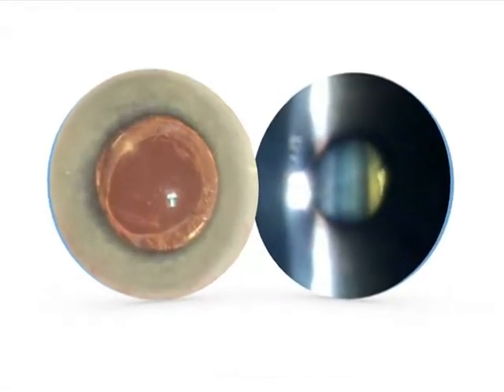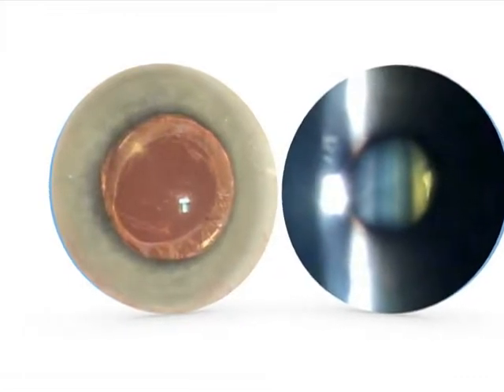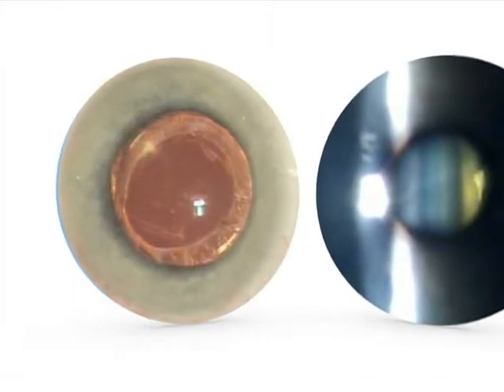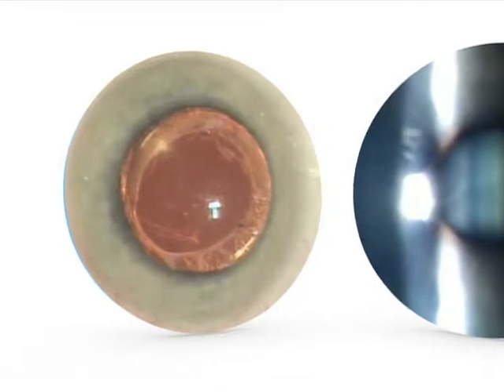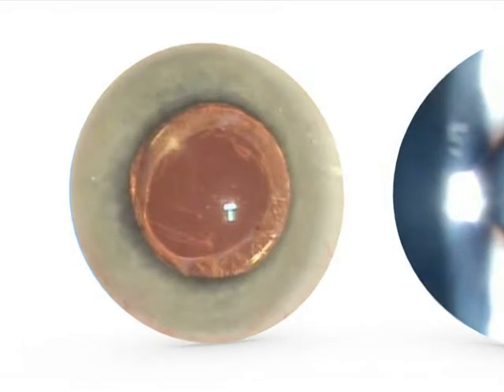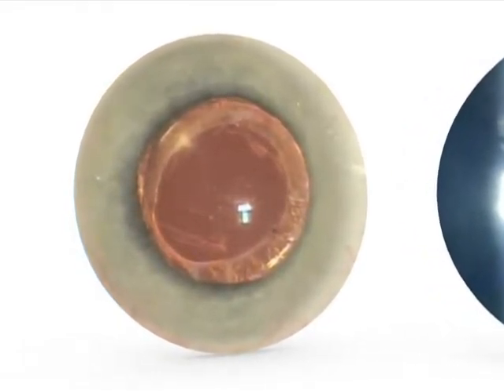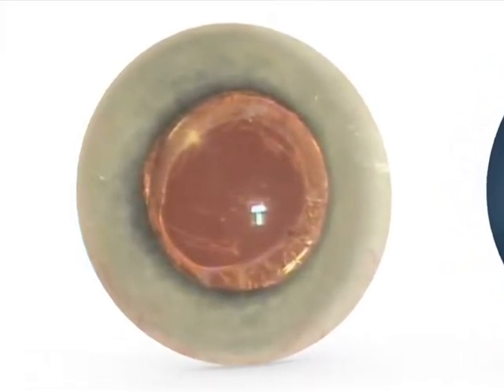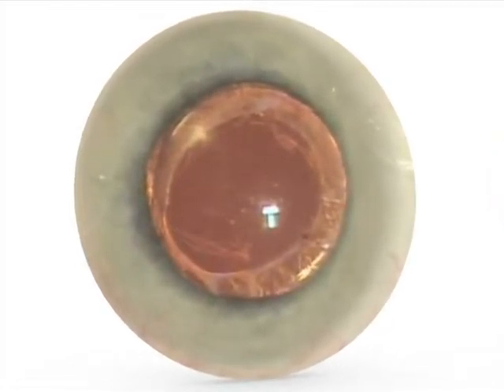What can you do now to achieve multifocality in both eyes? Phacoemulsification and diffractive multifocal IOL implantation on the cataractous eye is a standard option. But do you want to exchange the IOL on the monofocal pseudophakic eye after five years? Even after some months an IOL exchange can be traumatic, especially if the posterior capsule has been opened as it is here — vitreous loss during the IOL exchange may be inevitable.